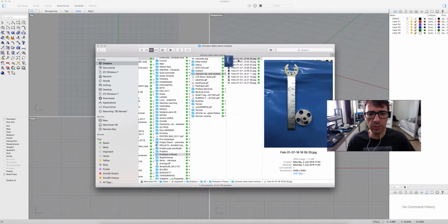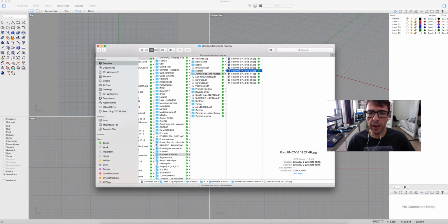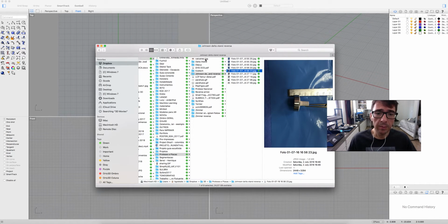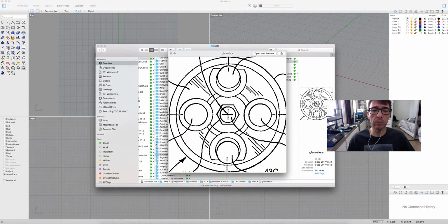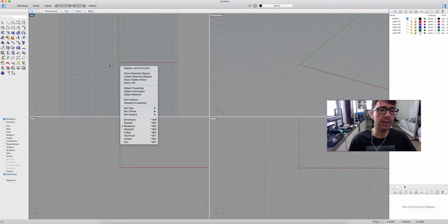Most of the time I do it like that, okay? And with this picture, we also know for sure the distance of the peg and the diameter of the peg. But we're going to use an image just like that. We know for sure that this cylinder is 28 millimeters. So let's start right there.